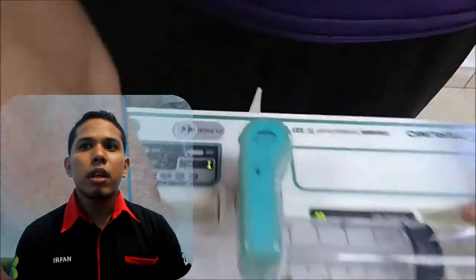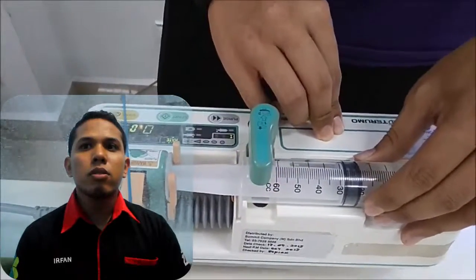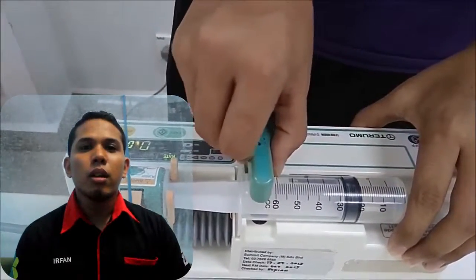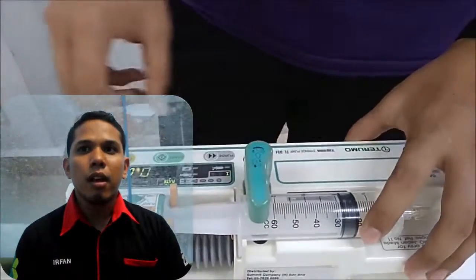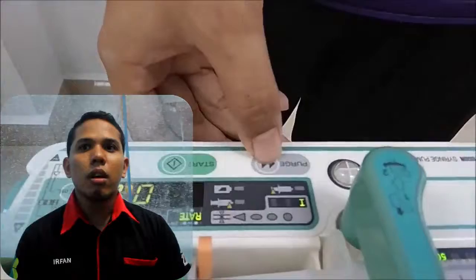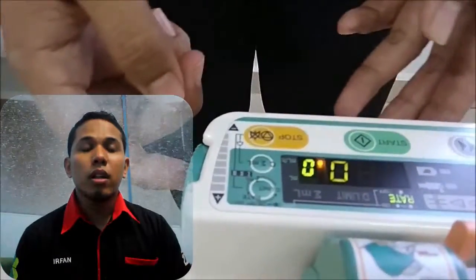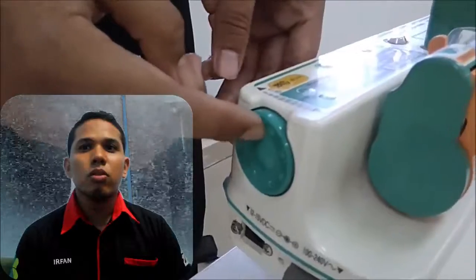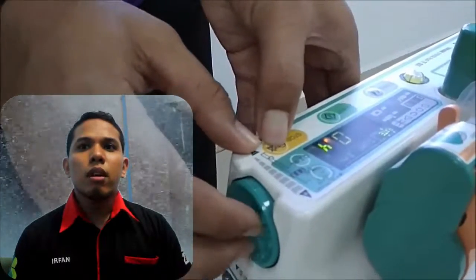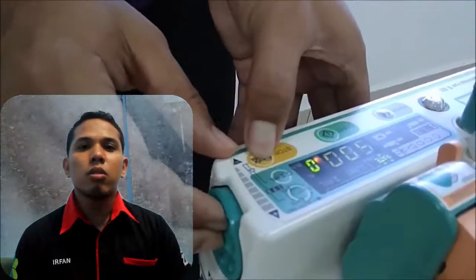The signal obtained from the RPM detector will be compared with the reference signal, where the result of the comparison will show the motor instability. The motor will reduce its speed if the rotation is too fast, and vice versa will increase the speed if the rotation is too slow, so that the motor cycle is stable. The pump is designed to have high accuracy and is easy to use.